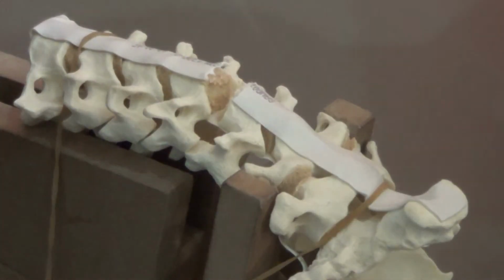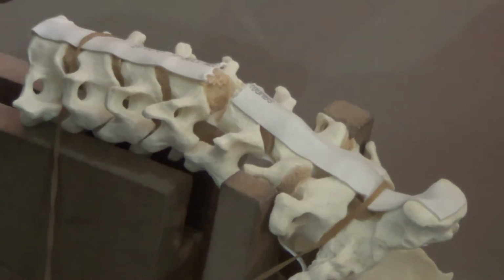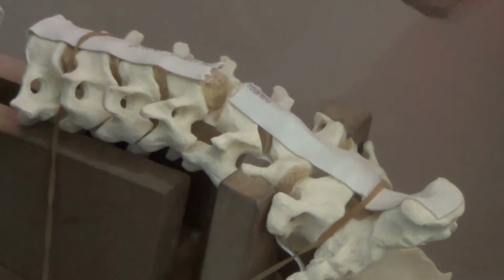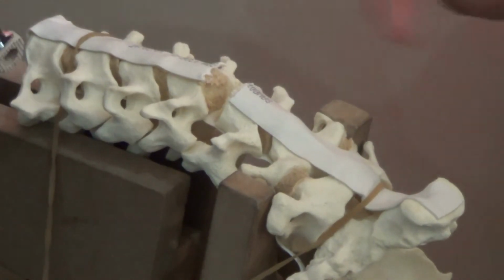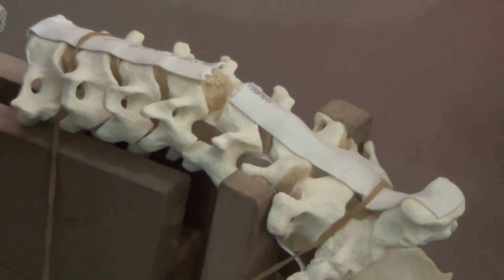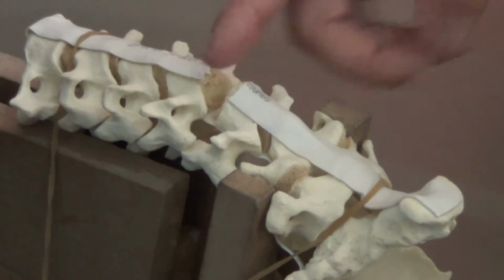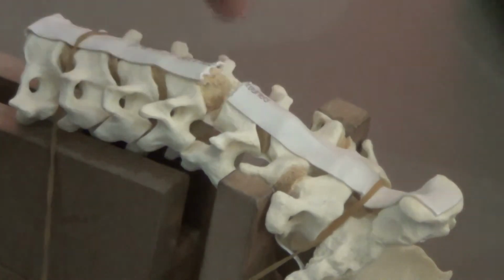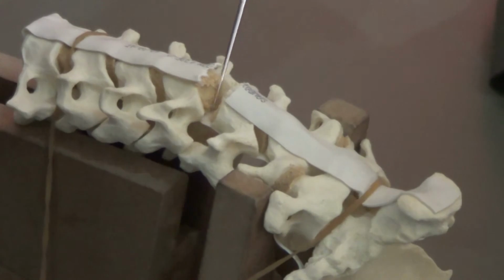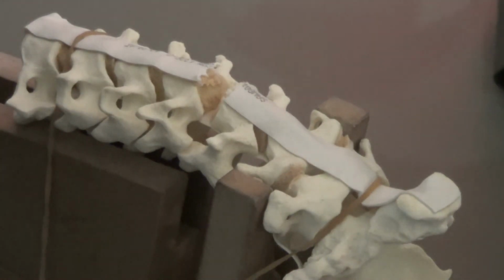Then by using your cutting Kerrison, this is the piece, you will cut a small piece. Then you will see, and there is a dural hook. Dural hook. You can feel whether the dura is free, and also you can feel the nerve. You can feel this is the dura.